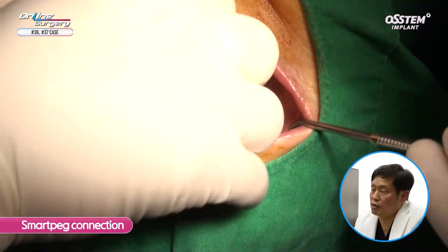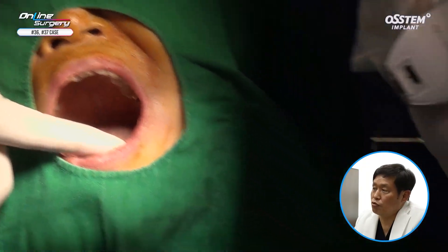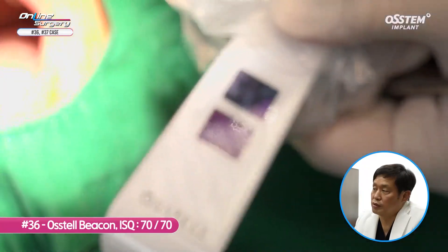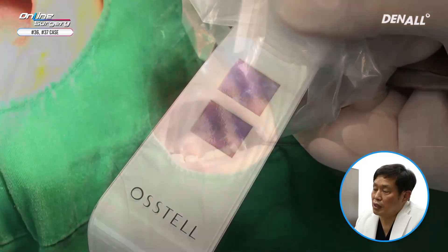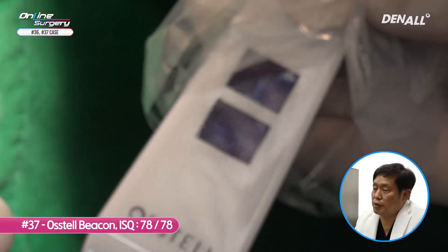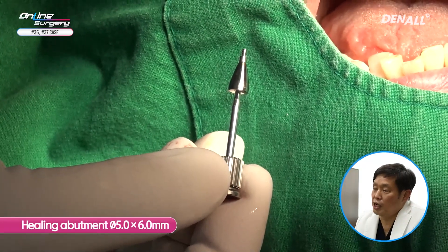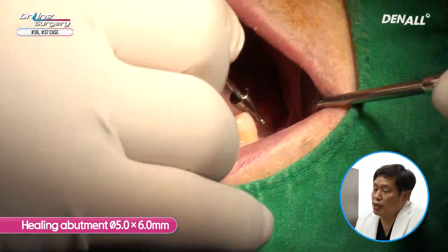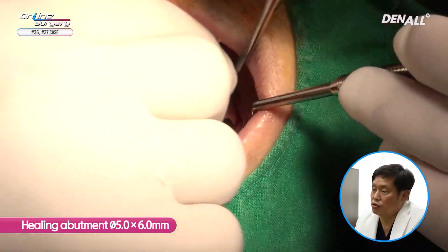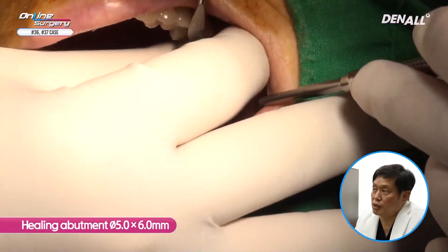The smart peg is connected to measure ISQ value. In number 36, it is 70-70. In number 37, it is 78-78. Favorable ISQ value was achieved. Healing abutments are connected — 5.0 x 6.0 mm healing abutments are connected. Healing abutments have been connected.